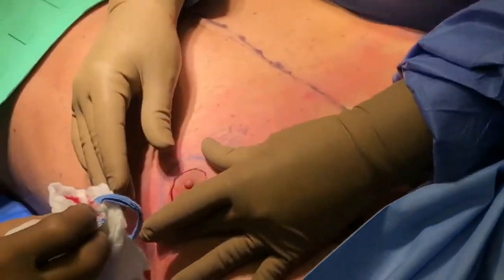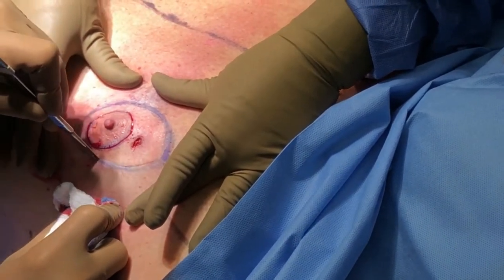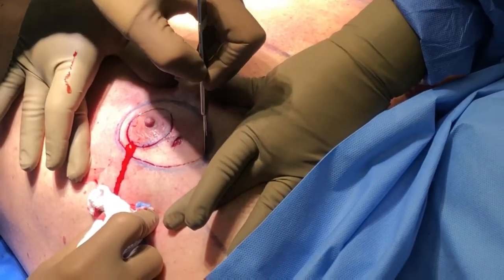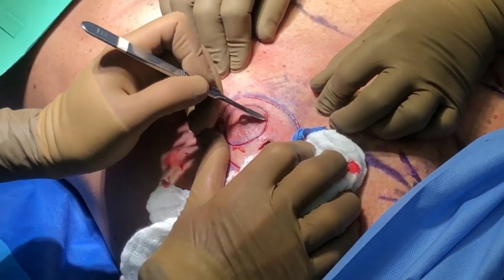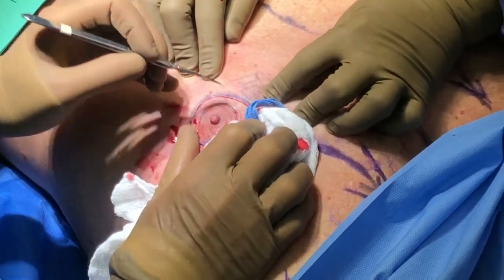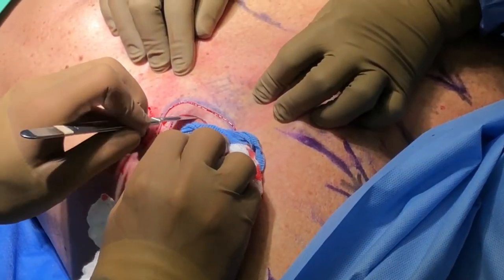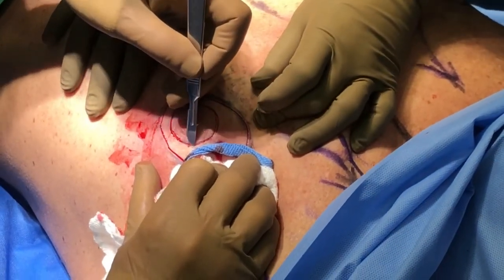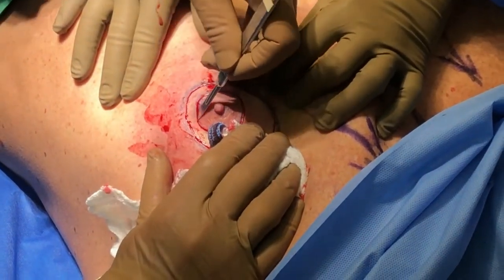I'm just going to go on the inside of the circle. So this is where we're going to de-epithelialize it. And then I'm going to go in and get my gland. Might as well just get this done right now, so we're not wasting time later with all this bloody fluid. It's good to do it now because we use the skin's resistance to be able to de-epithelialize this.